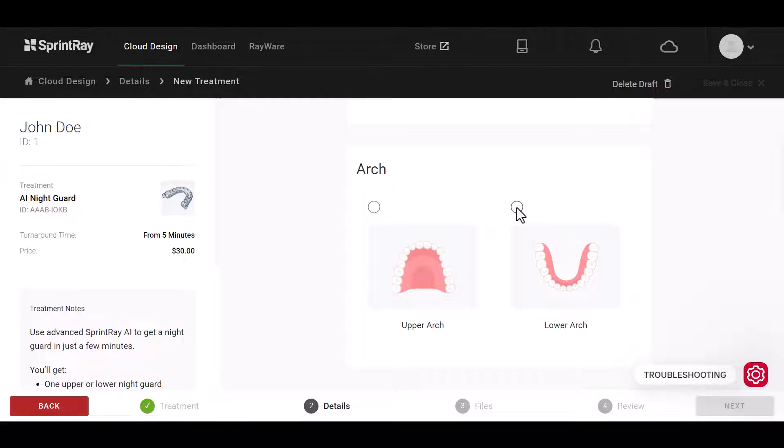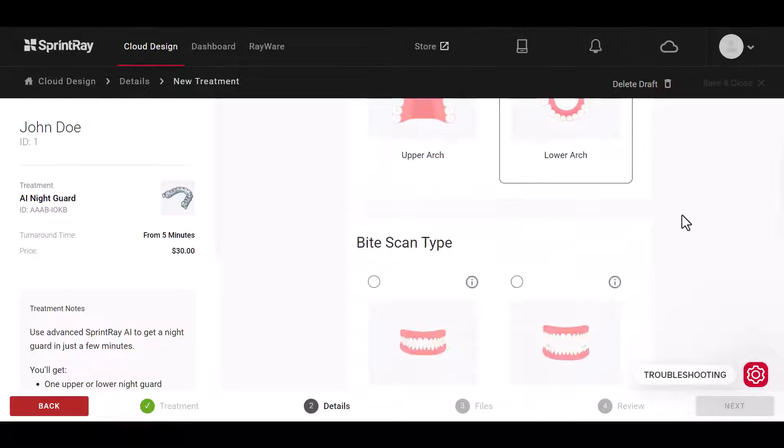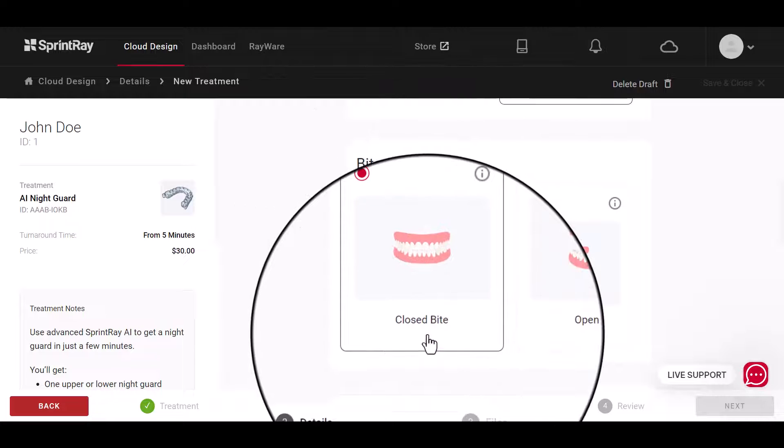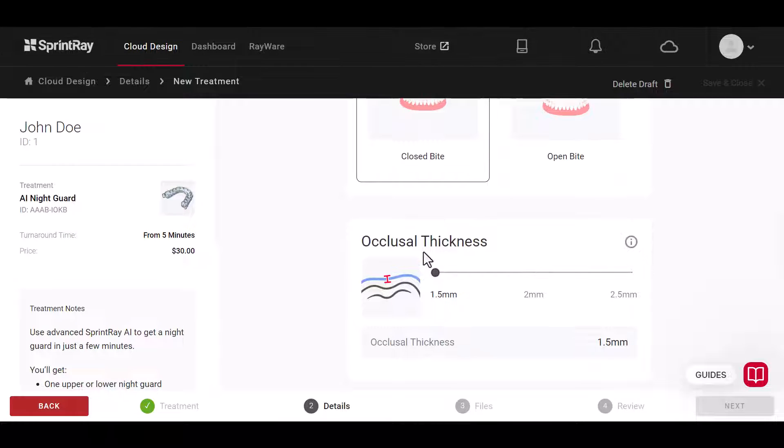Start by selecting the arch you would like for this design. If you choose closed bite, you'll be given the option to customize the occlusal thickness of the nightguard. By increasing the occlusal thickness, the biting surface of the guard will become thicker, opening the bite virtually.